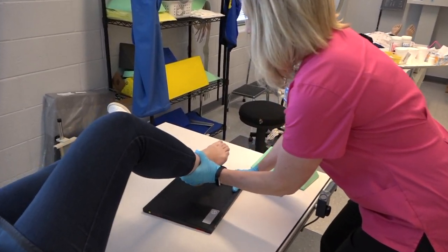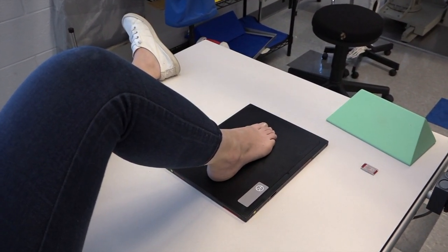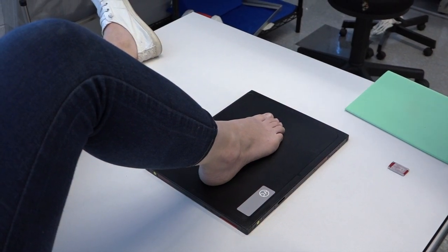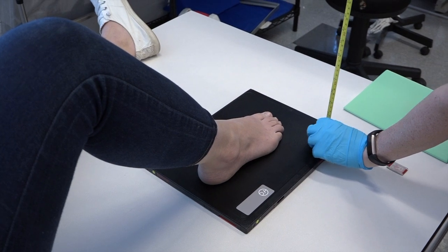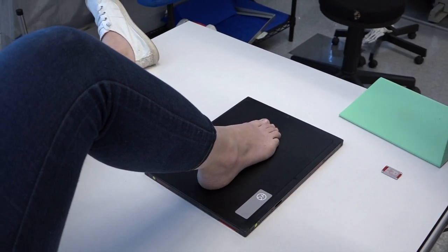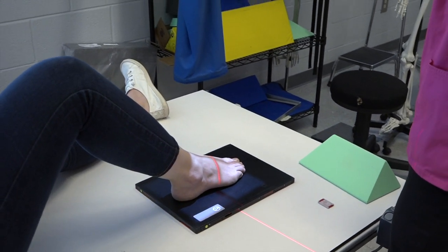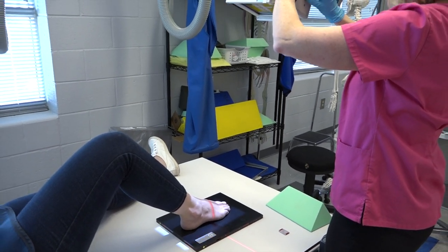Place your foot in the middle of the image receptor. We're going to angle 10 degrees to the base of the third metatarsal. Measure. Make sure that you have your 40-inch SID. Our angle again is 10 degrees, and that's just to open up the joint spaces on the foot.